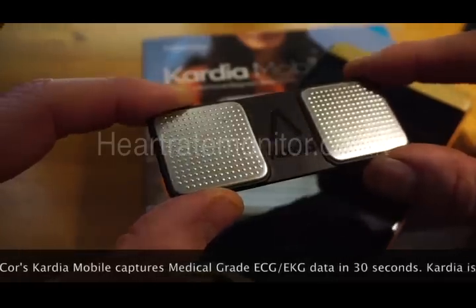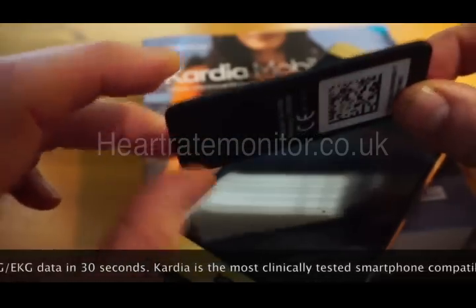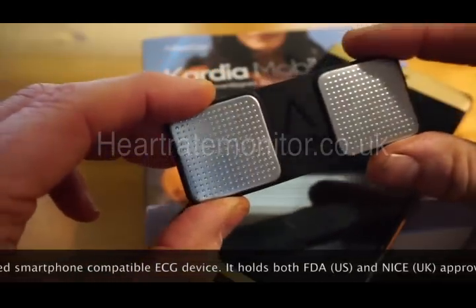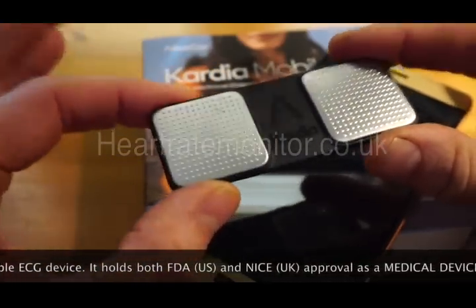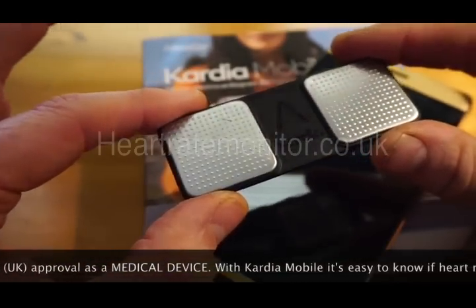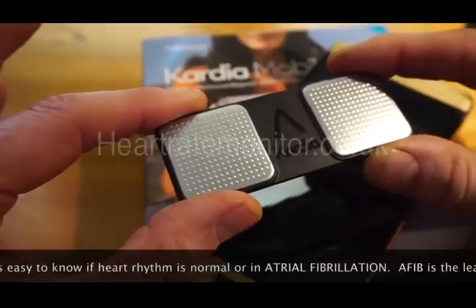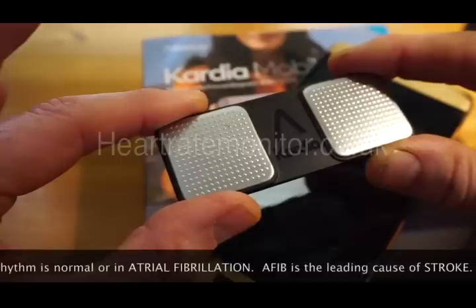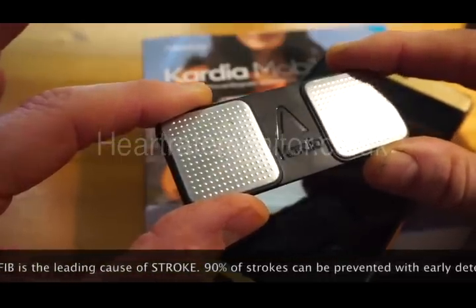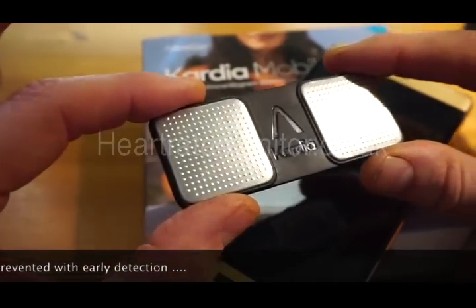The most important thing to know about the Cardia Mobile is that it is medically approved. In the UK it's been through a NICE assessment and come out as a medically approved device, which means if you take readings from this and present them to your GP or doctor, they have to take them seriously. If you take heart rate from a wrist watch like the Garmin, Polar, TomTom or similar, those are not medically approved devices and they don't take ECG traces — this does.